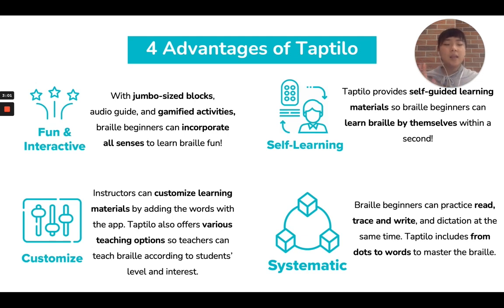And fourth, Taptilo is systematic. With Taptilo, Braille beginners can practice read, trace and write, and dictation at the same time. Also, Taptilo includes content from dots to words, so students can master Braille really systematically.